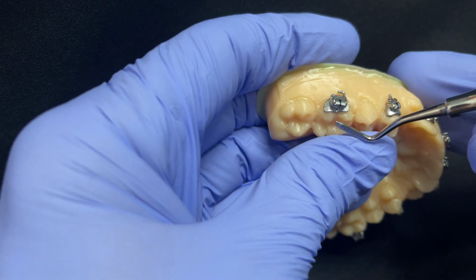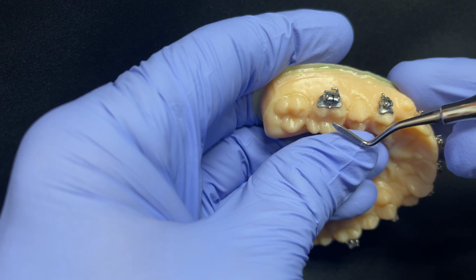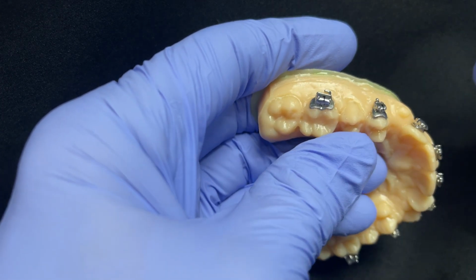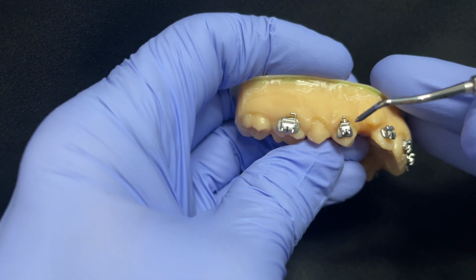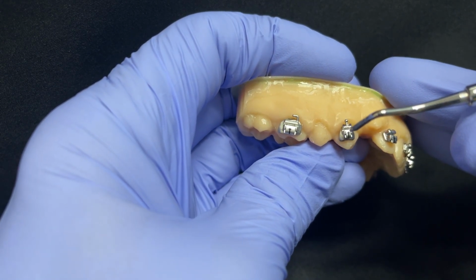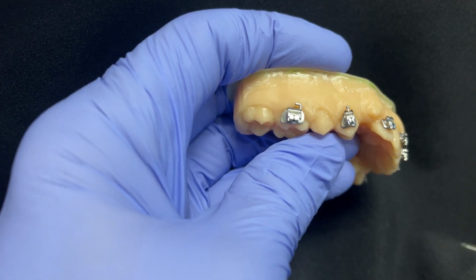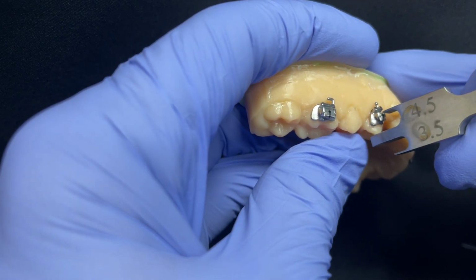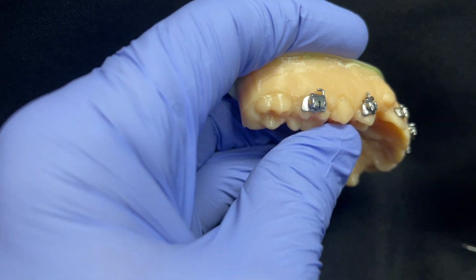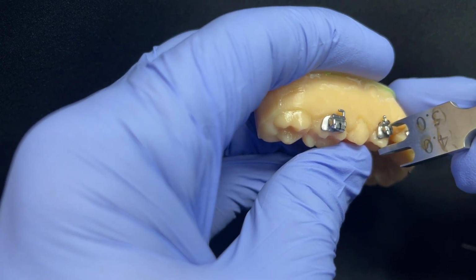So we're going to look at the difference between this. We're going to directly bond this one. Okay, so we'll look at the difference between the 6 and the 4 here. And the 4 does have a little bit of a mesial inclination, which is indeed reflected in this mesial inclination of the bracket position. And I like it. That 4 should be about 4.5 millimeters from the, and we've got it up there about 5 millimeters, which I'm okay with. That's about 5 millimeters there.